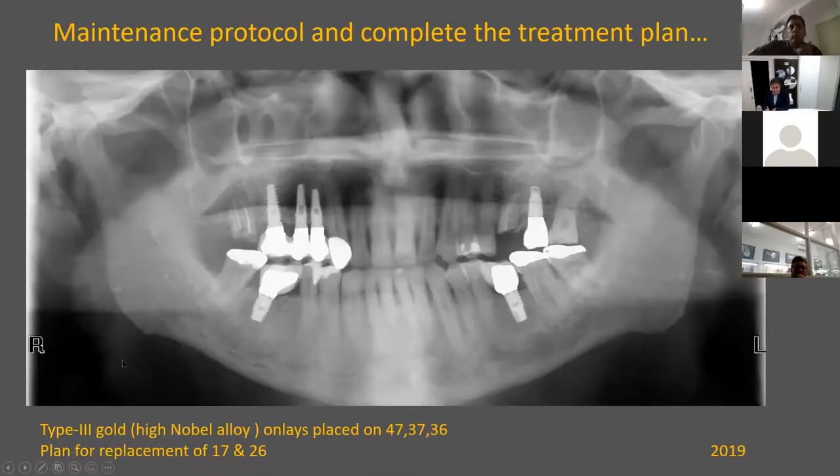Now, coming back after 7 years, look what happened. I can see my implant still in place. We have a metal ceramic bridgework here against the implant. That's holding very well, maintained. There's no fracture, everything's fine. The problem is the zirconia's gone. Zirconia crowns have gone completely.